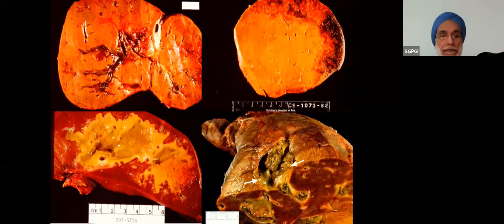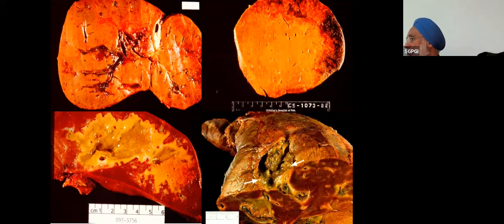And here are some gross pictures. Thrombi, subcapsular infarcts. As in all organs, the area most away from the hepatic artery, that is under the capsule, will suffer the damage. And so one of the things we recommend when you're doing donor biopsies is to not just give a needle, but also give a wedge. So sometimes the ischemia will be hyper accentuated under the capsule. And we usually recommend both the right and the left lobes be biopsied, and we ask for a wedge as well as a needle. And these are examples of abscess formation, and this is an infarct.